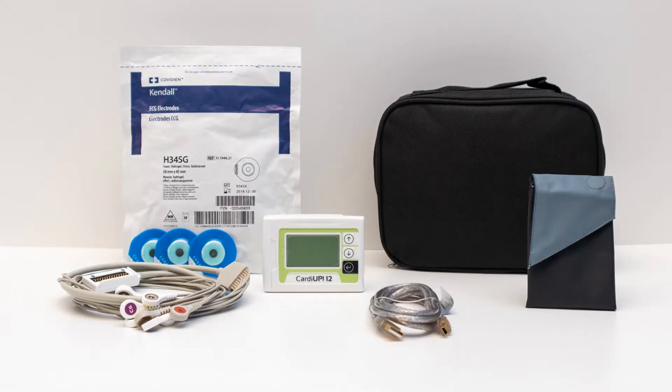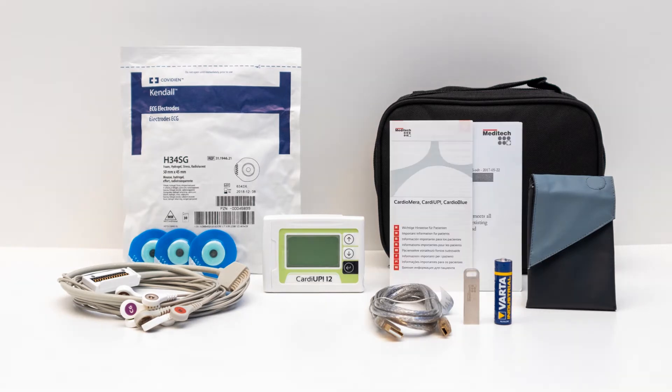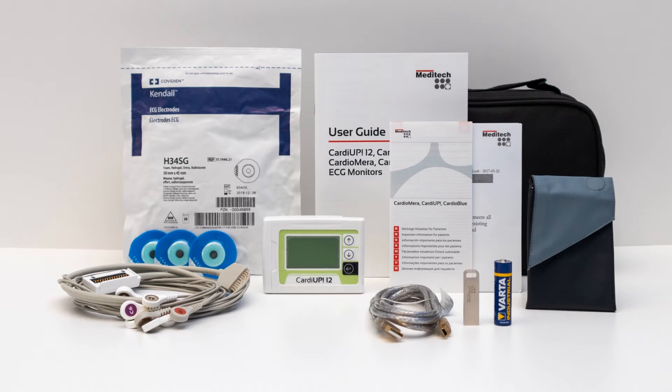The kit also includes 1 standard mini-USB cable for data transfer, 1 high-capacity AA-sized battery, 1 data carrier with the latest version of CardioVision software, 1 set of user documentation, 1 quality certificate, and 1 user guide.